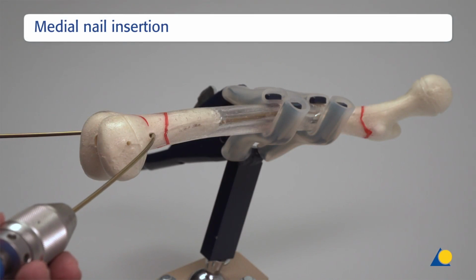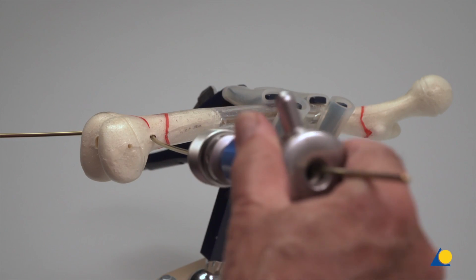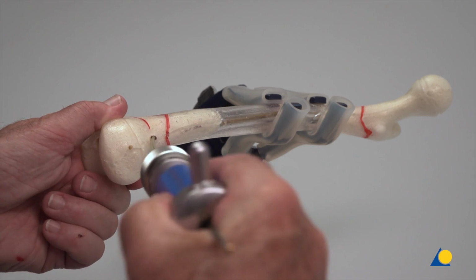The insertion point at the medial side of the medullary canal will be opened in the same manner. The second nail is inserted into the metaphysis and advanced up to the fracture zone.